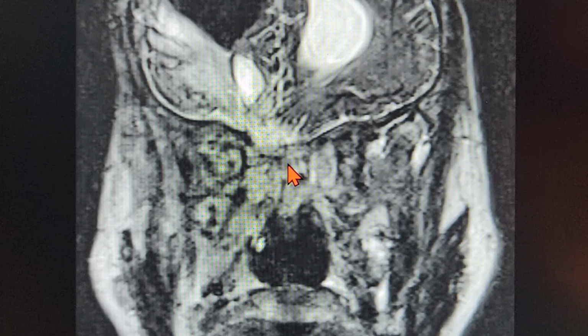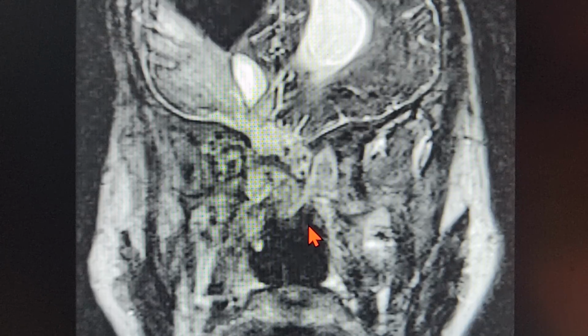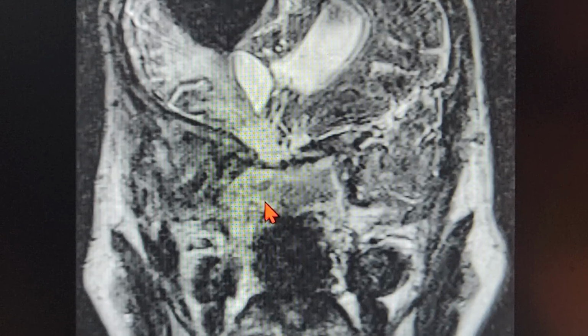confirmed either with an active CSF stained with fluorescein coming out, or you can go and ask the anesthetist to perform a Valsalva. But make sure you do not keep on asking the anesthetist to perform Valsalvas once you have repaired the initial CSF leak site. Once you've put the fat plug, once you've put the tissue glue, the free fascia, never ever repeat or ask the anesthetist to give Valsalvas, because that may dislodge the fat or somewhat hamper the area of repair. Always make sure of that.